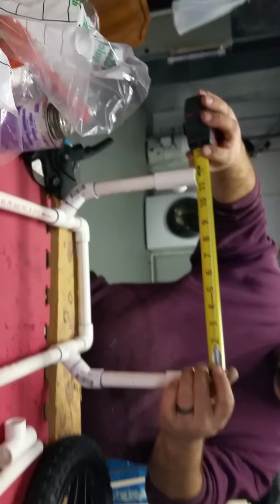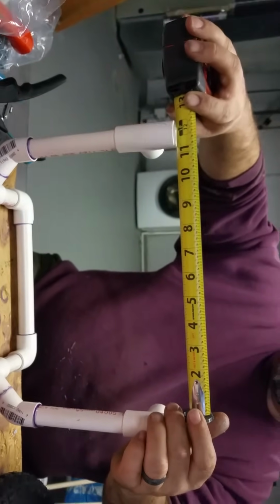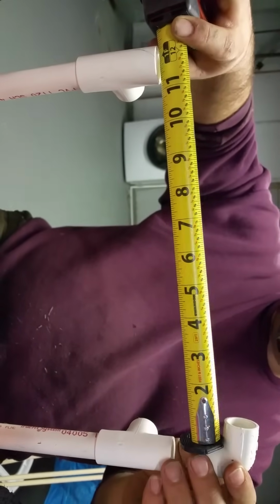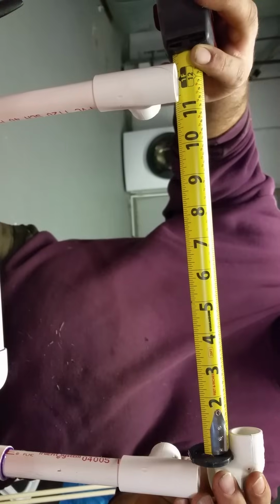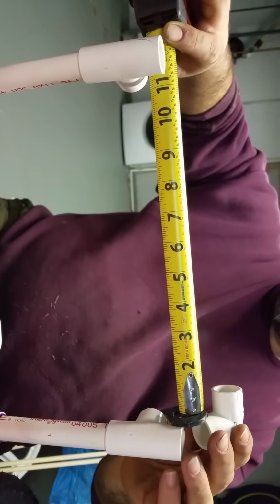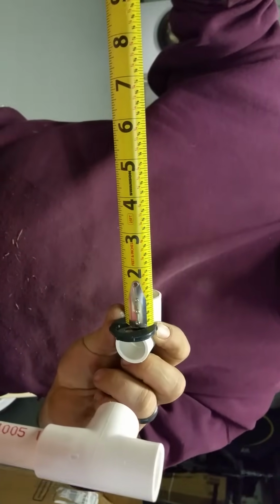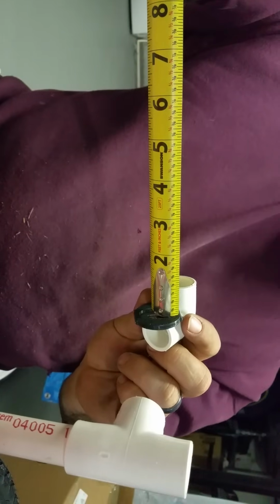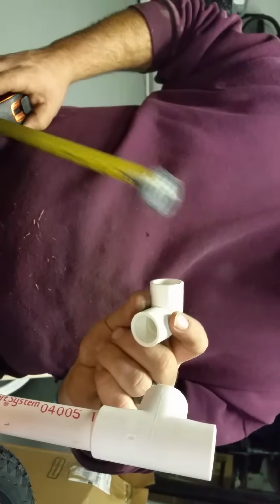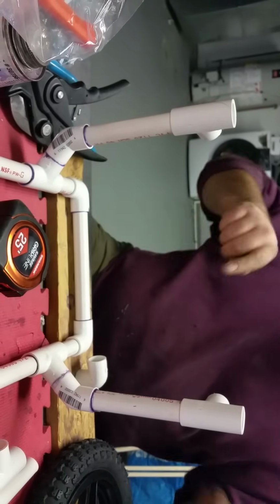Okay, what we do next is we set the T's on that are going to go on next, that are going to be holding the back support bar. And we measure across the top of those. This one measures 11 1/4 inches from inside to inside measurement. The 90-degree bar that we're going to be putting on is actually going to go with a piece of PVC towards the back. And that gives you the width of your support bar, which is going to be 11 1/4 inches.